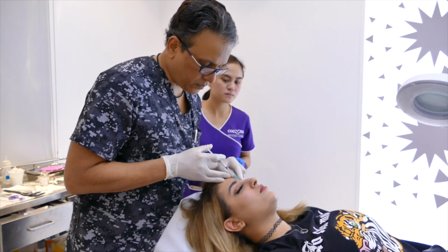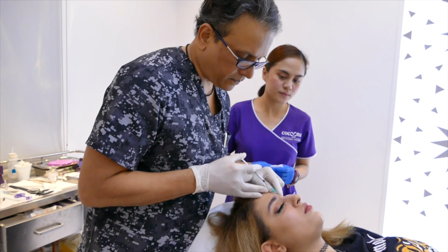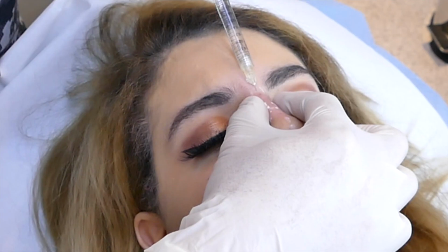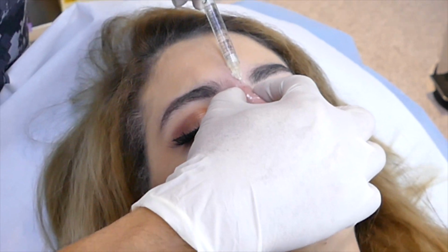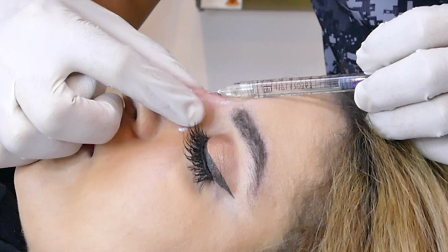The injection starts with the nasion area. This injection is supraperiosteal. About 0.1 to 0.2 is enough. Any more volume can get displaced laterally and increase the width of the nasion.